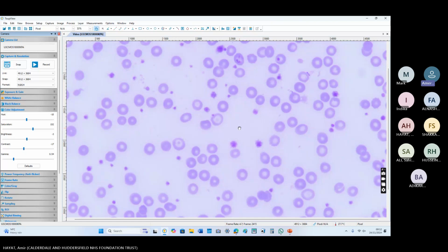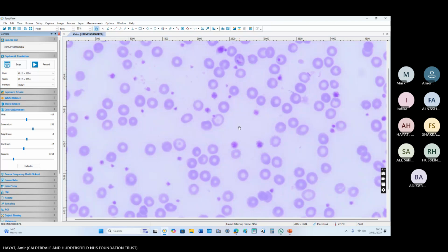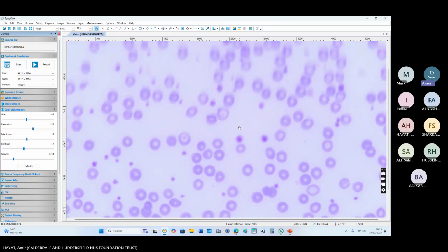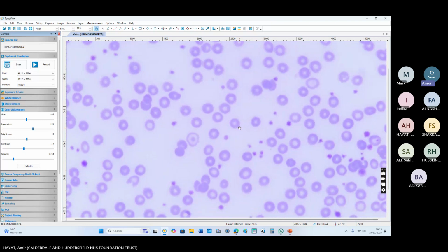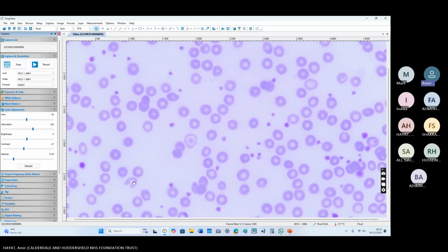This patient is in DIC because of the abnormal coagulation picture, and there were 2 schistocytes. I'd expect to see more fragments, though. Yes, that I was looking for, but I could see only 2 up till now. The platelet count's still quite high. Platelet counts are high. You can say this is also a schistocyte.